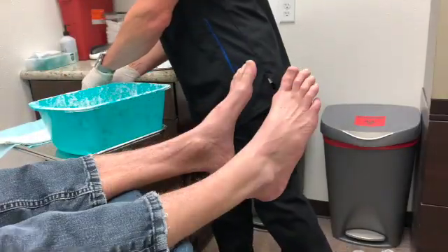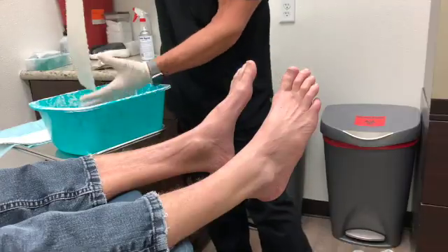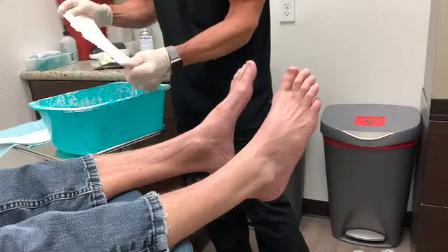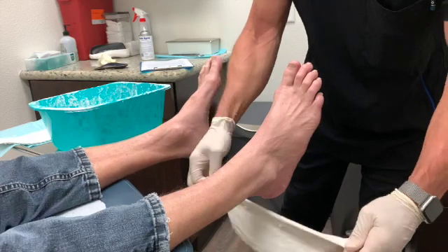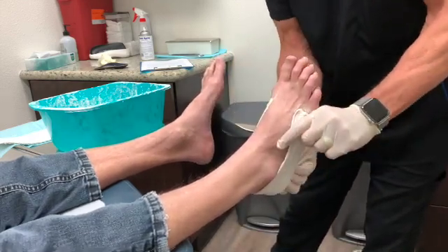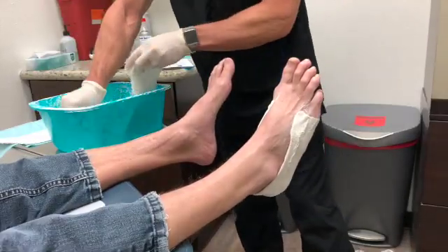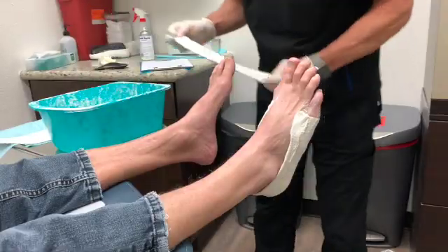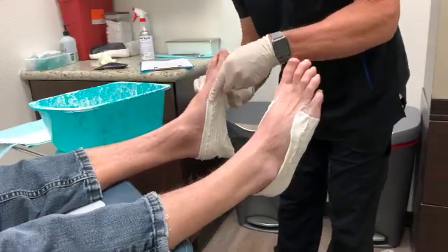The casting technique is literally old-school. We have some plaster here and basically with a little bit of water you get it wet and bring it around the back of the foot. The arch supports are designed to keep the patient in what we call the neutral position. A neutral position is when the foot is neither inverted nor everted, or locked nor unlocked.